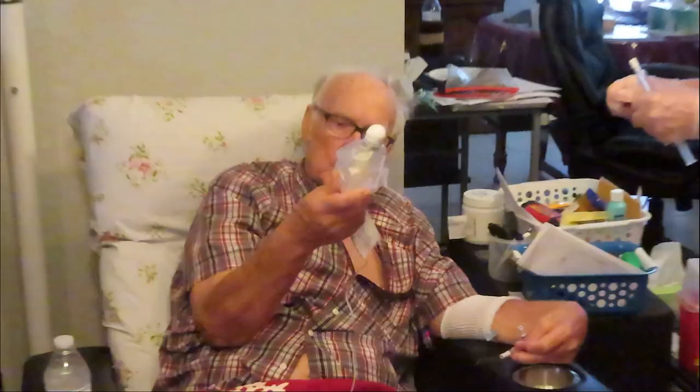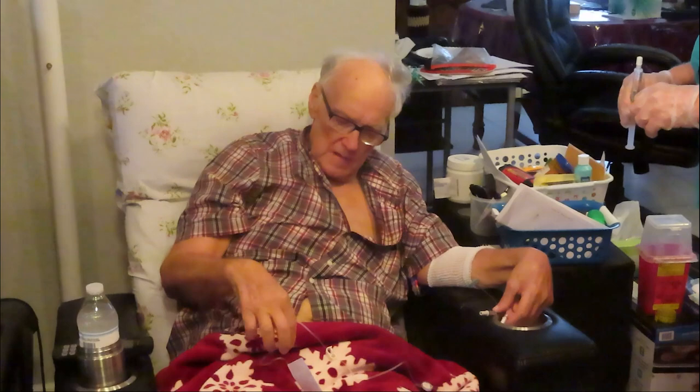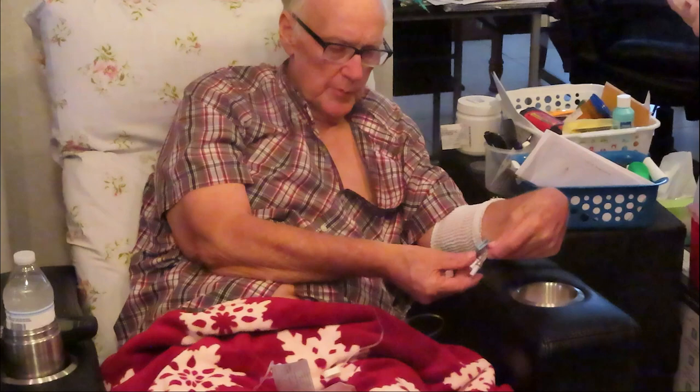Here's my IV. As you can see, the ball is totally collapsed. So to remove it, I already unscrewed it, but I'm going to show you anyway. You go to the valve and make sure that you shut it off right here, in case there's a little more pressure in there, so you don't get the stuff all over the place. I have two outputs for the PICC line. We got to clean them both.